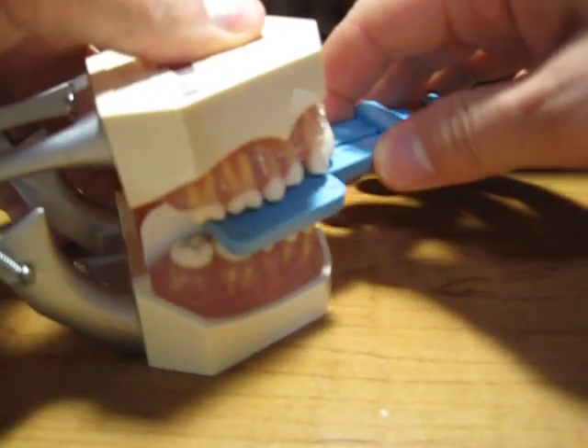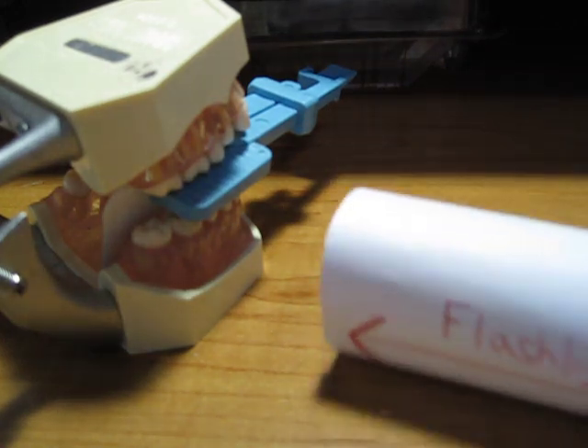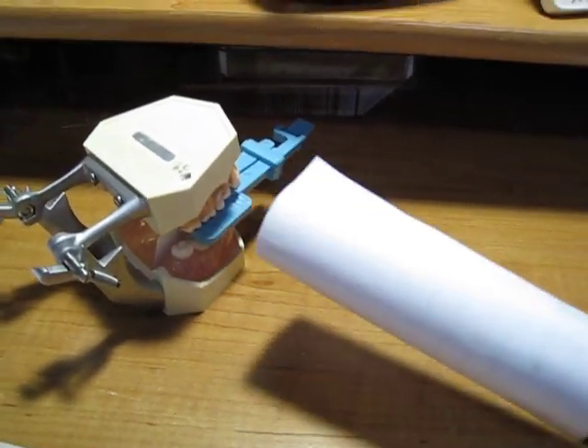So now you put this in here, have them bite, and you're ready to expose from here.